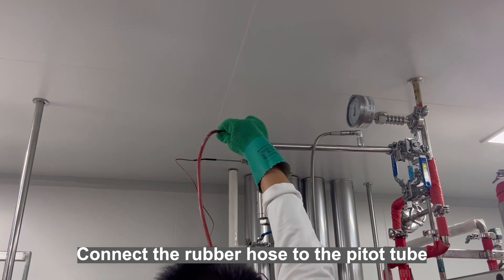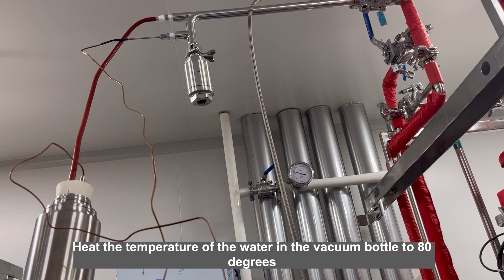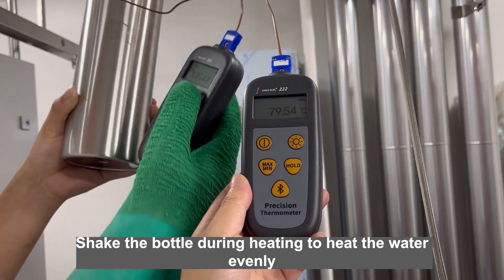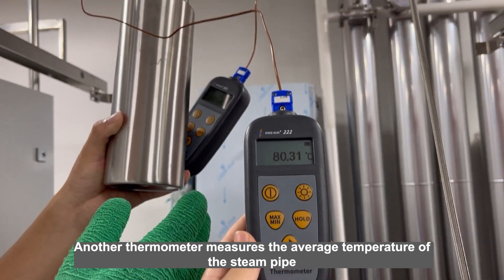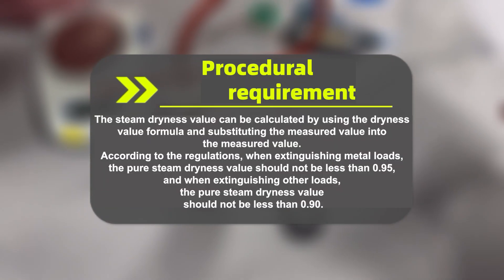Connect the rubber hose to the pitot tube. Open the pipeline steam valve to the maximum position. Heat the temperature of the water in the vacuum bottle to 80 degrees. Shake the bottle during heating to heat the water evenly. Another thermometer measures the average temperature of the steam pipe. Weigh the heated water and measure the temperature of the heated water. The steam dryness value can be calculated by using the dryness value formula and substituting the measured values.